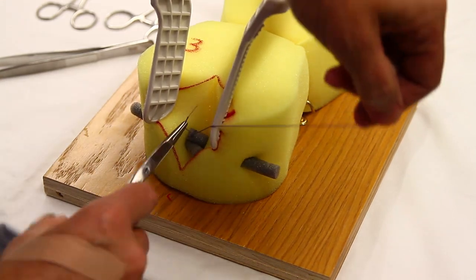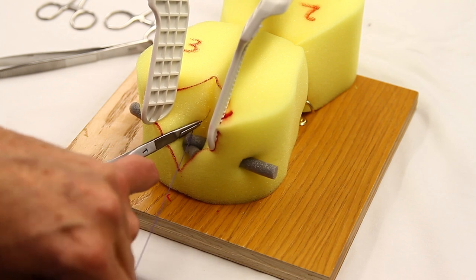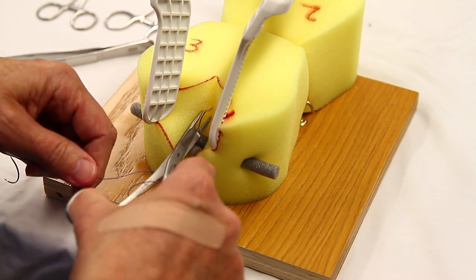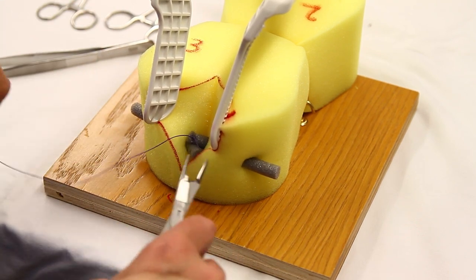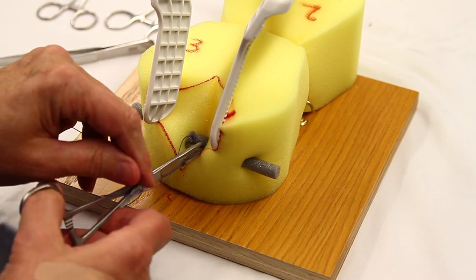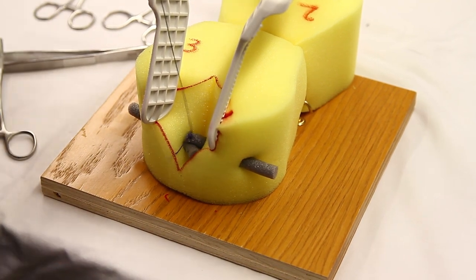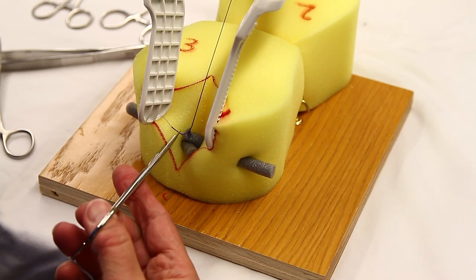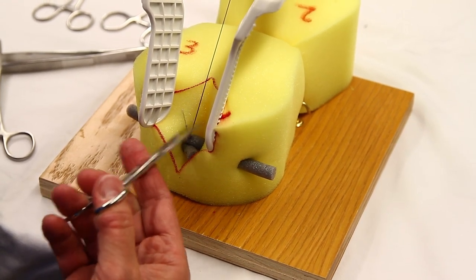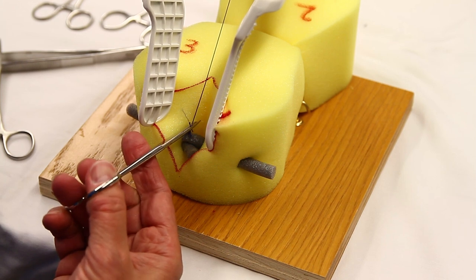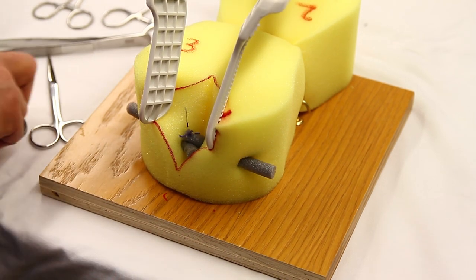Like I said with vicryl, one of the knots needs to be a double knot. Vicryl likes to untie itself. Try to put square knots down and put at least three in and then you can trim that short leaving at least that half a centimeter so it can't come untied.